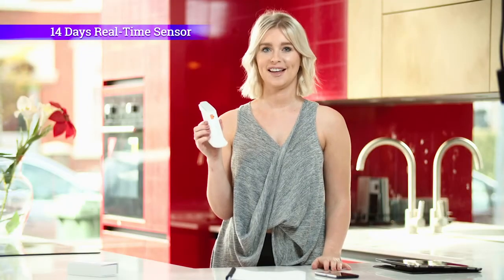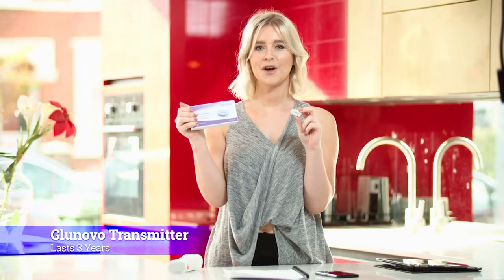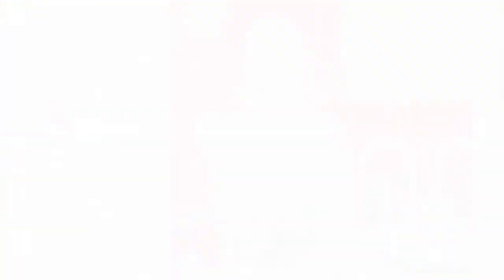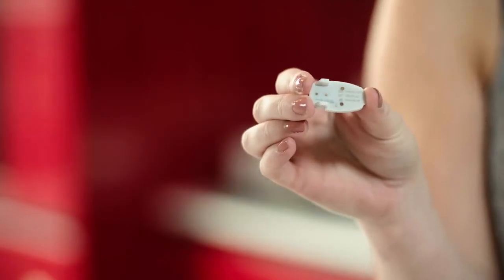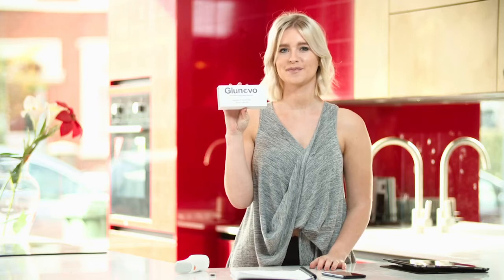The GluNovo i3 sensor lasts 14 days and gives you real-time readings every three minutes. This is the GluNovo i3 transmitter — this lasts three years. The transmitter sends your glucose readings via Bluetooth to your mobile device. Please note there is a transmitter ID and security PIN at the back of the transmitter. This ID is also printed on the back of the box the transmitter came in. I would advise you to make a note of this, as you'll need it later when setting up the CGM system.